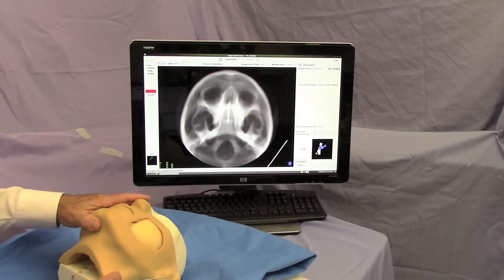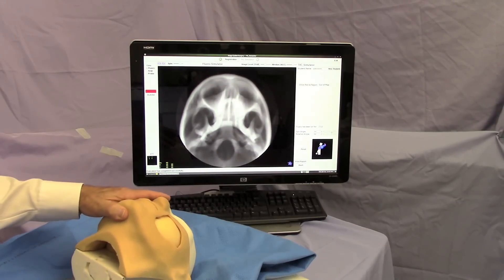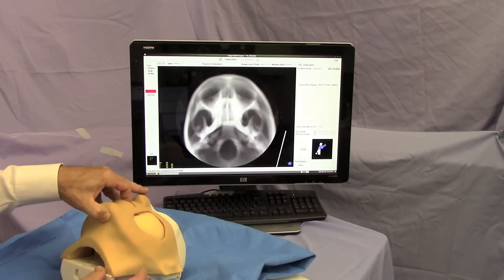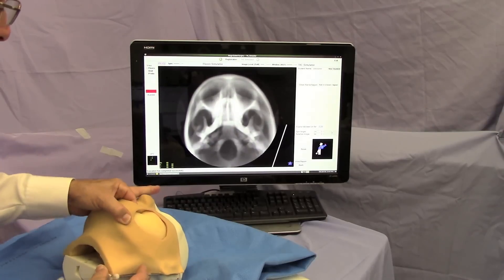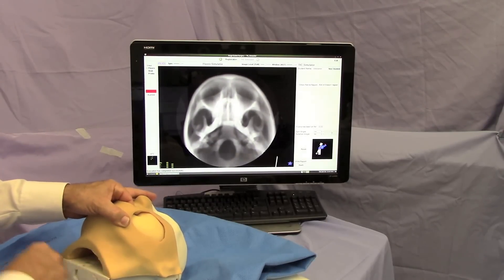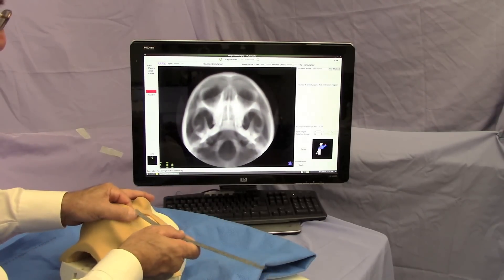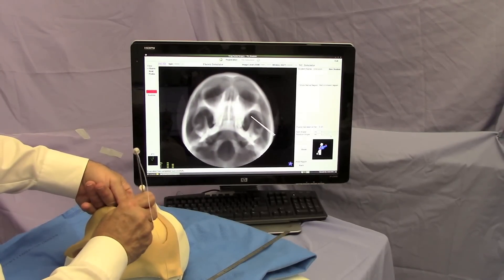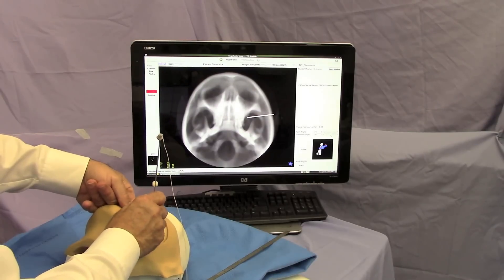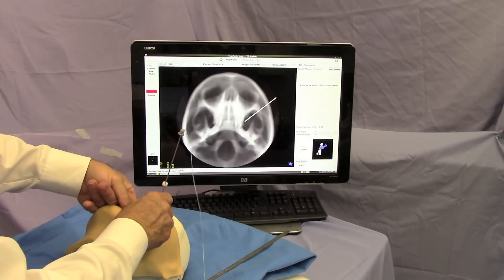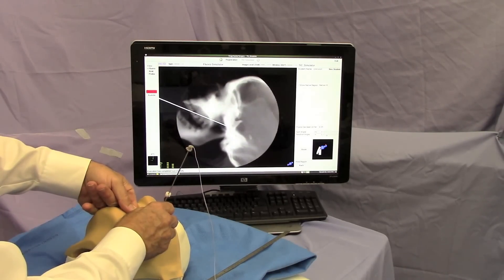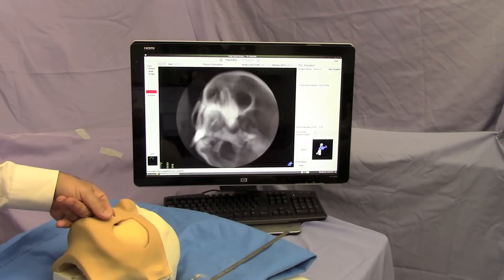The physical model is grabbed by the user and oriented so they can have a good view of the foramen ovale. The same procedure that is used in the real patient is used in this model. The material allows the exact same probe to be used as would be used in real surgery. After insertion and identification that we are appropriately in V3, rotation is requested to establish depth of the probe.